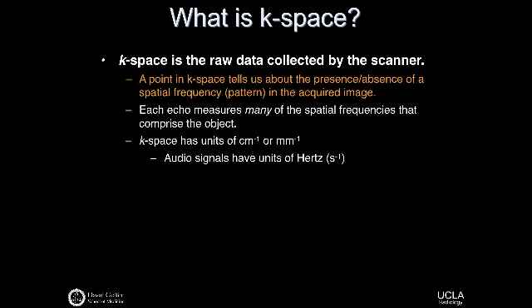Okay. So let's take a deeper dive into K-space, and I think we had a slide like this similarly. This is maybe slightly rearranged, but I think the thing to really remember here is K-space is the raw data collected by the scanner, right? This is what we actually store and record most immediately, if you will.